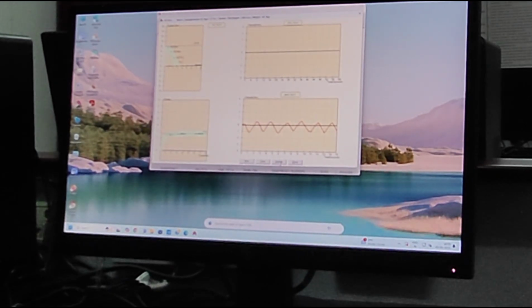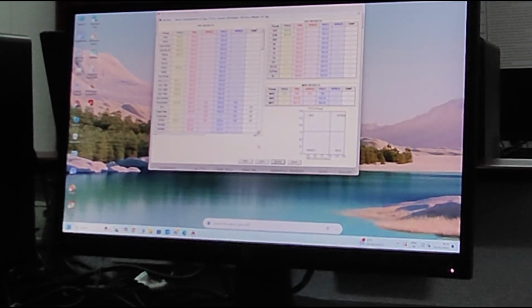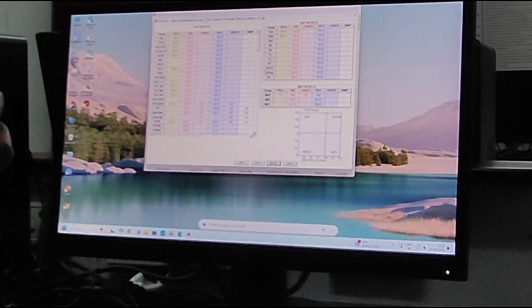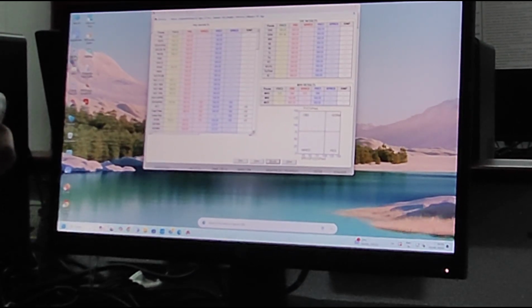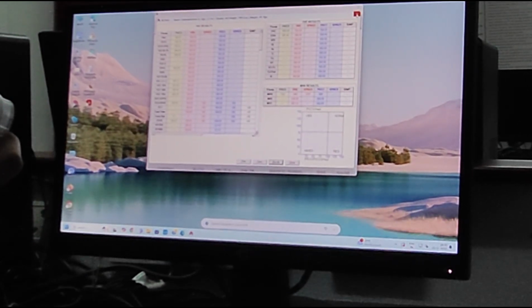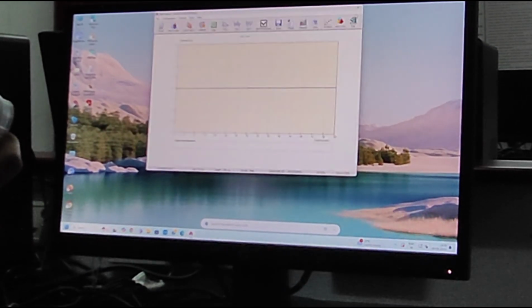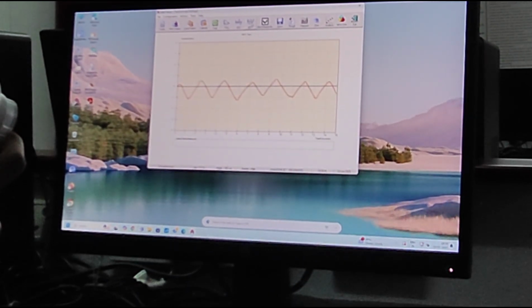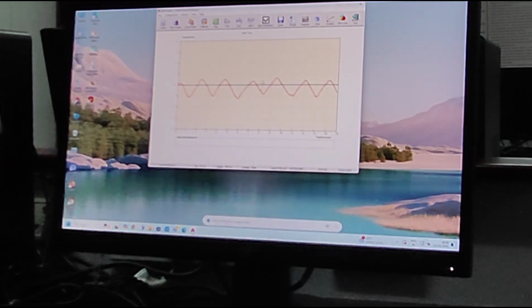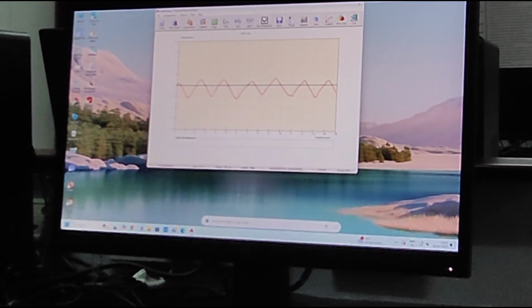Here we have the results of the patient. By analyzing each data, there will be a conclusion of the total lung capacity. The lung capacity will be analyzed and the final results will be taken from the system. Thank you.